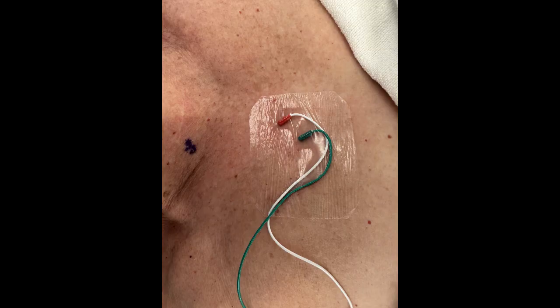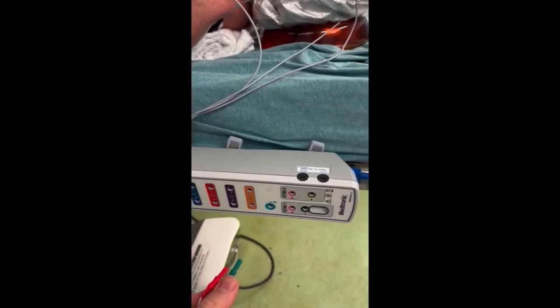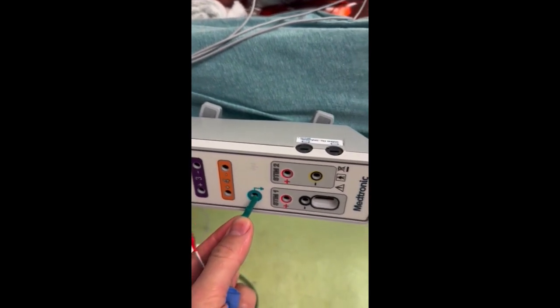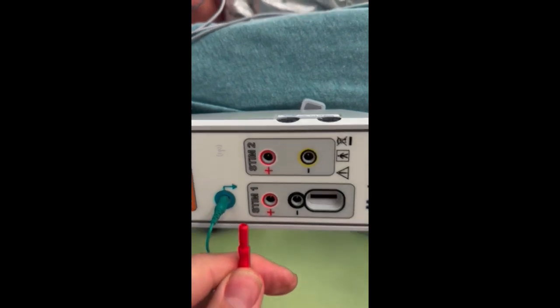Place the ground and stimulator leads in the sternal skin about five to ten centimeters from your field. Each of the needle portions of these leads is placed intradermally. The needle of each lead must not touch the other lead.